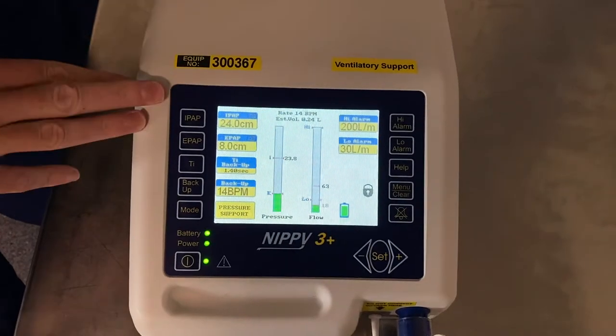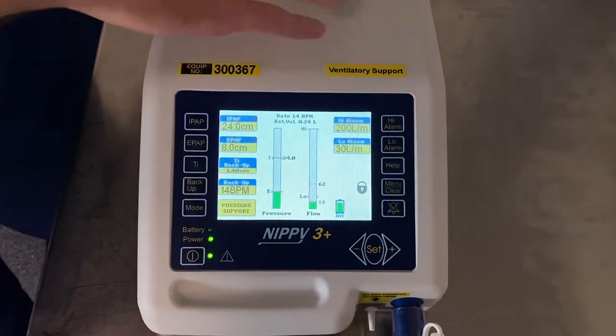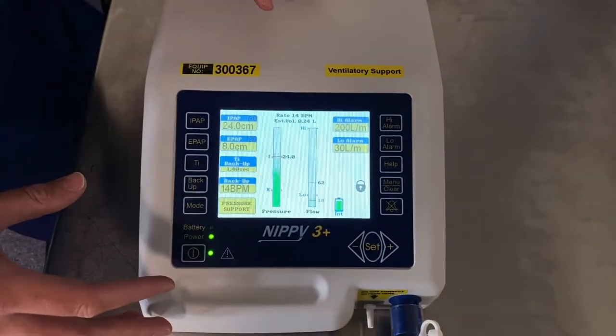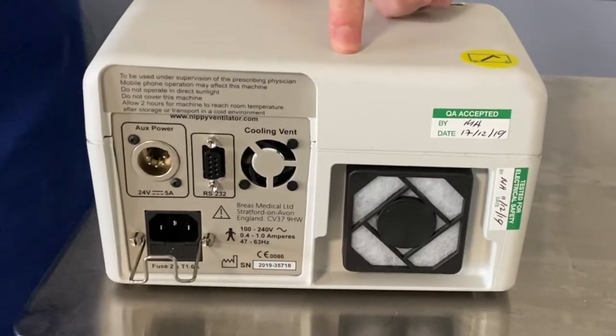So this is the NIPPy 3 Plus. You can see it's switched on at the moment. We're going to start from the back and work our way around to the front. So this is the back of the NIPPy 3 Plus ventilator.